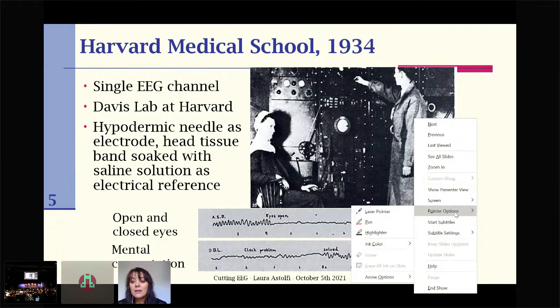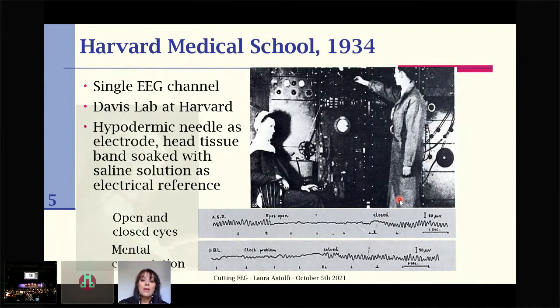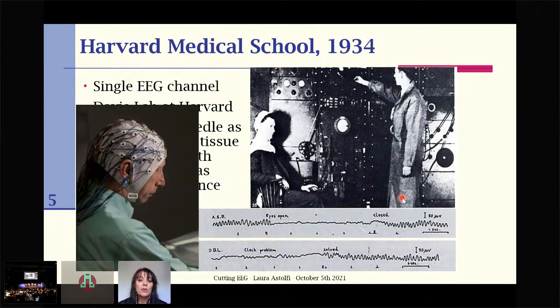But today, luckily, we are able to measure quite inexpensively many channels on the scalp, 64 and more, if we want to move to the so-called high-density EEG, which does not mean high spatial resolution still, but it's useful in that direction. And also the amplifiers are now very small and portable. So this is something that we can deal with now.